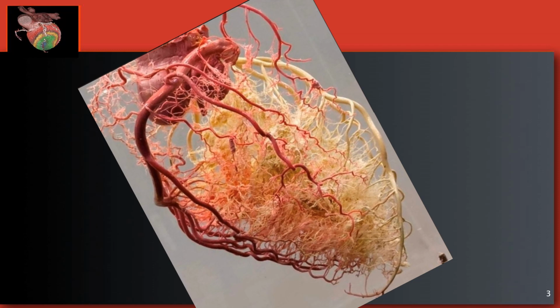So patients could have heart failure, they could have coronary artery disease, but because it's in this microvasculature, it goes undiagnosed. The only way to actually assess and diagnose microvascular disease is with PET MPI imaging with myocardial blood flow evaluation. You can't see it with a heart cath, CT, or any other diagnostic invasive or non-invasive testing, other than cardiac PET MPI with myocardial blood flow reserve.